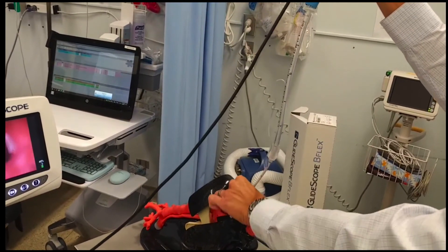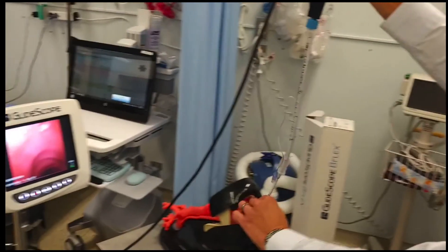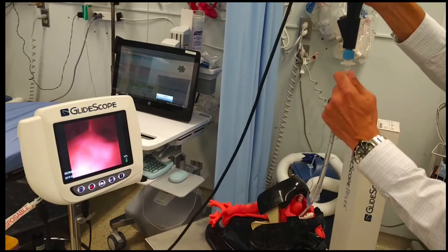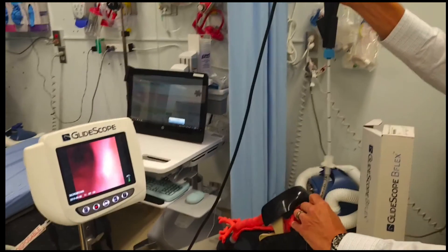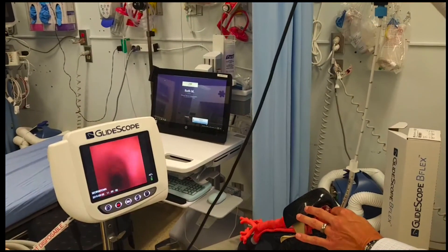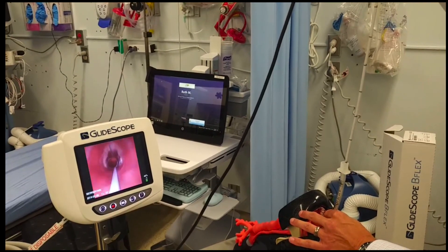It's going to pop eventually — there we go, we're in. There's the carina. Now you can advance the ET tube. As we pull out the scope, you can see the vocal cords and the glottis.